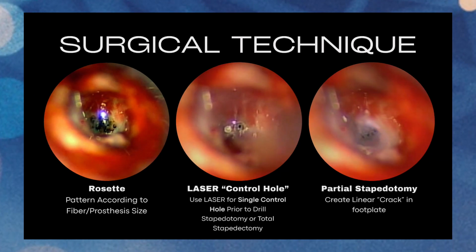Now, in terms of surgical technique, there are a few ways to do it. One way that we use is to make a rosette. And you can do this with any of the systems, but when we used the CO2 laser, I was a lot more likely to make a complete rosette. The rosette implies that you're going to not overlap your fields, okay?